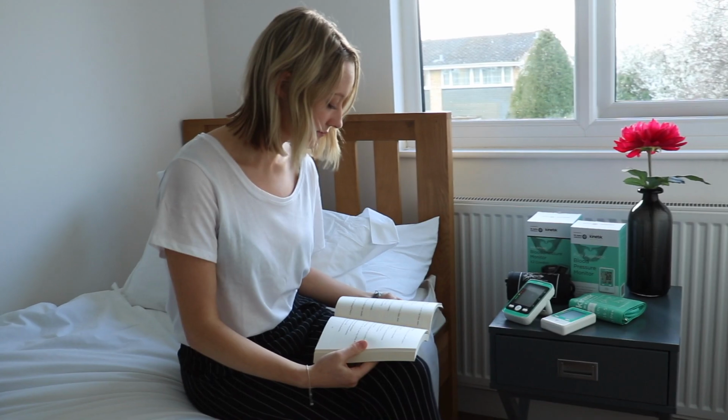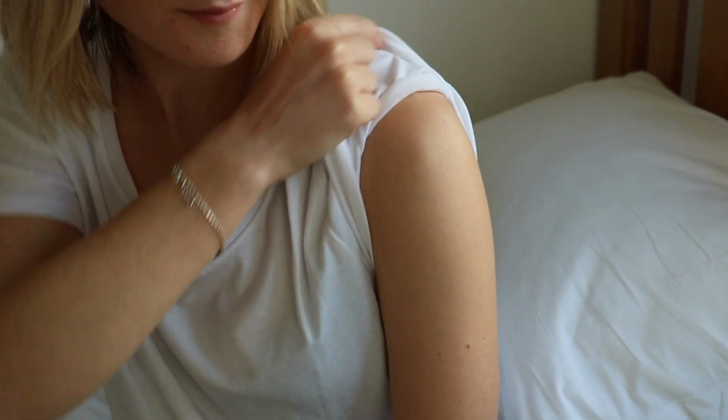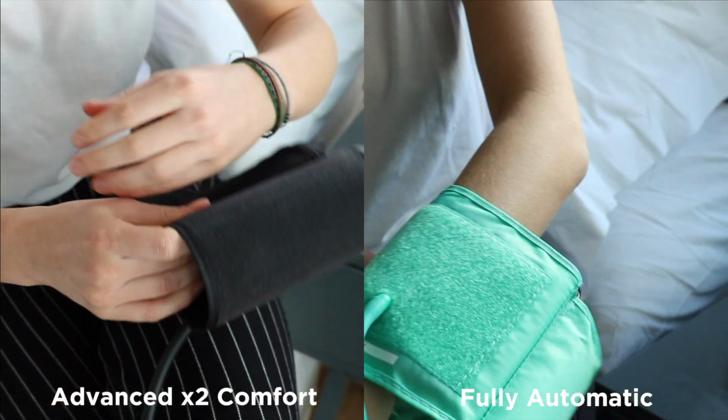Step 1. Relax. Rest for 5 minutes before taking your blood pressure. Don't eat or drink anything beforehand. Step 2. Apply the cuff. Use your left arm, making sure to remove any thick clothing, and rest your arm on a hard surface.